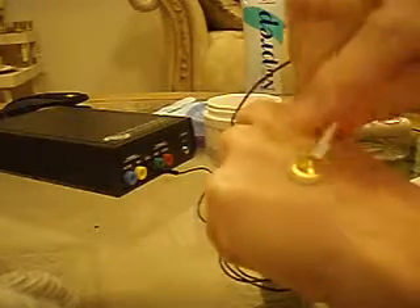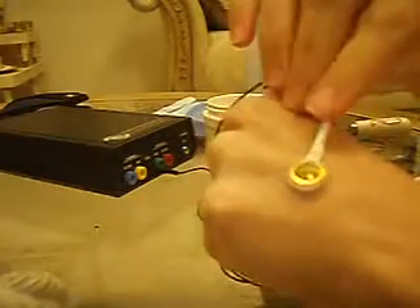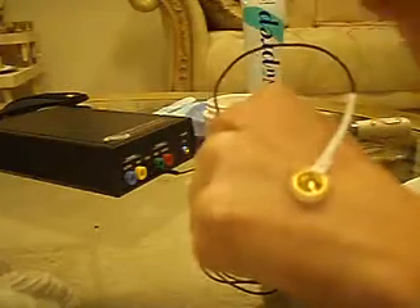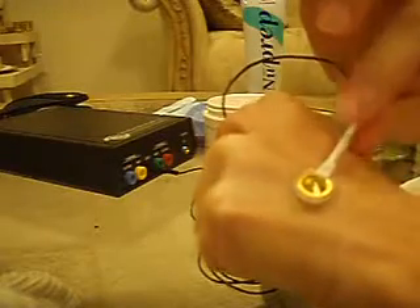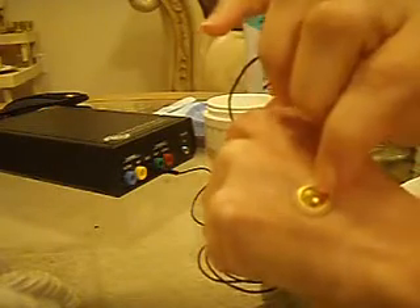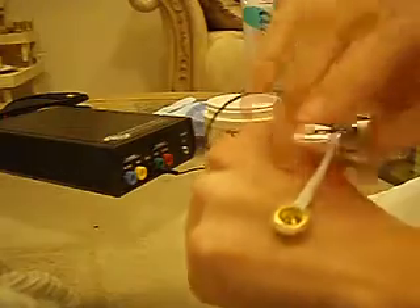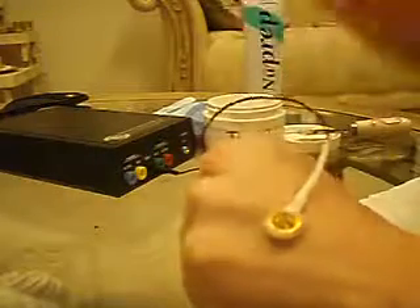You'll probably have a little bit of paste all the way around. You can see that's moving a little bit, which is why you probably want to have a headband to hold that wire in place and keep it from moving. When you press this down, you may get a little bit of paste coming out of that center hole. A little bit is fine, but if you have a large amount coming out the top, then you probably need to remove that, and you can do that with a Q-tip very easily.